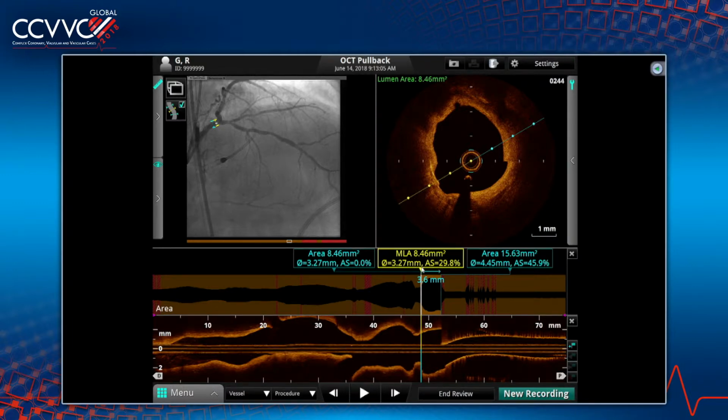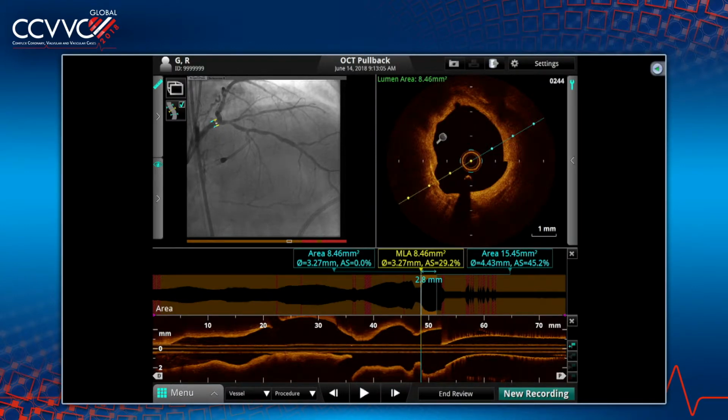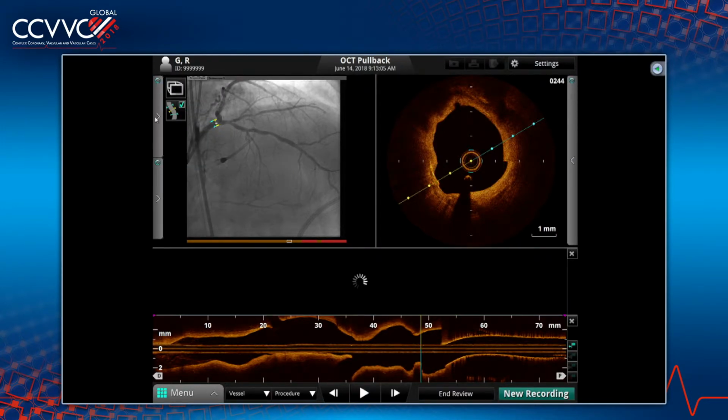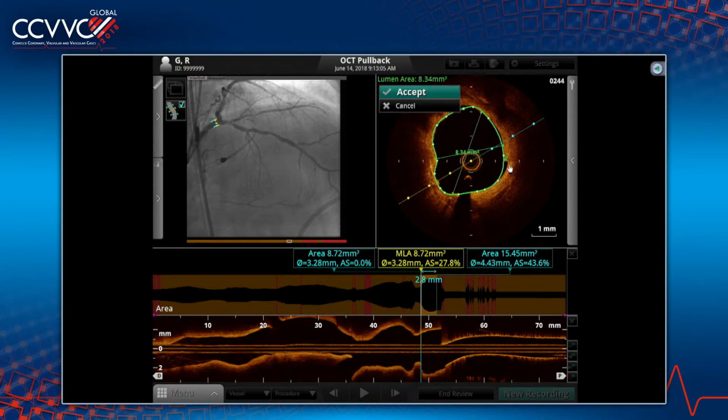And I love that she's developed a venue where you could send in your OCT image and have it expertly evaluated by our imaging team here. We built a very, very strong imaging team, one of the top core labs for OCT and imaging, with Dr. Narula here and Dr. Kini, and we've set up a very highly technical venue, and I think that to me is very exciting. And then the idea of incorporating that and Bluetoothing that into your procedure is going to be very important. Can you show us? Take us through the other OCT.